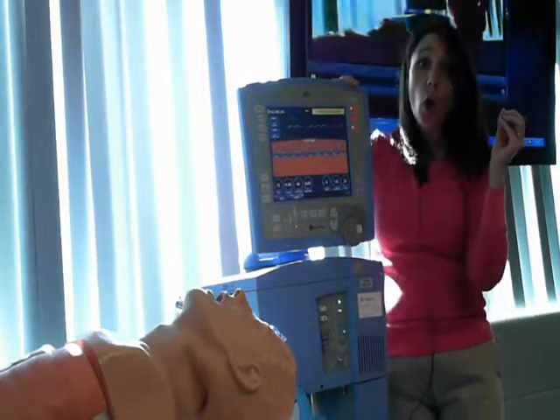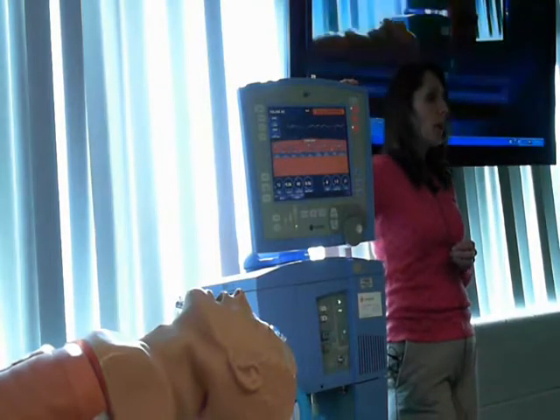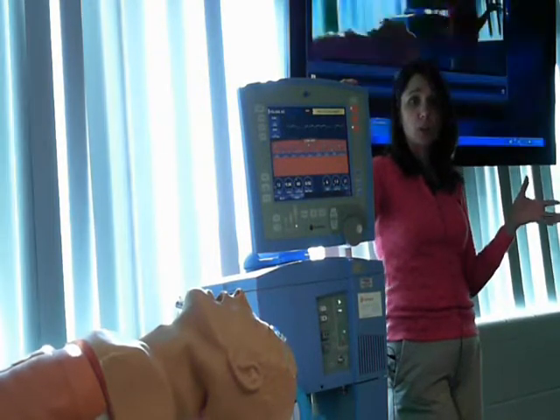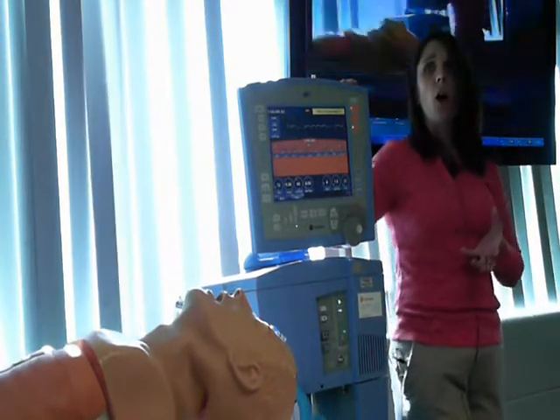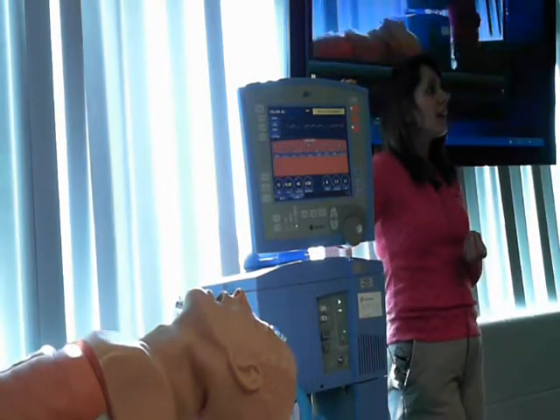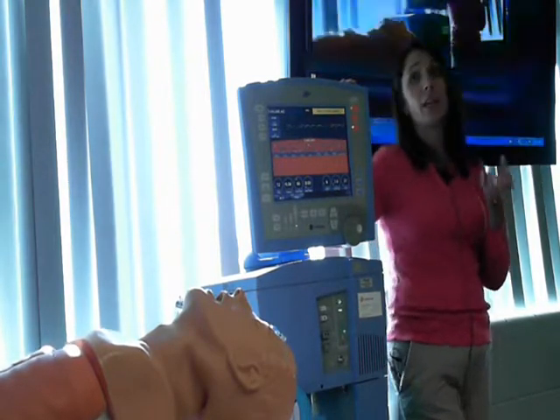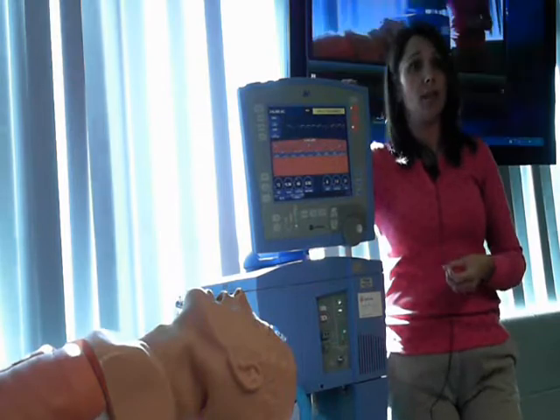The next setting that you will always have is FiO2. We can range anywhere from room air, which is 21%, all the way up to 100% oxygen. Okay? That is going to vary, once again, based on what is going on in your patient's disease process.